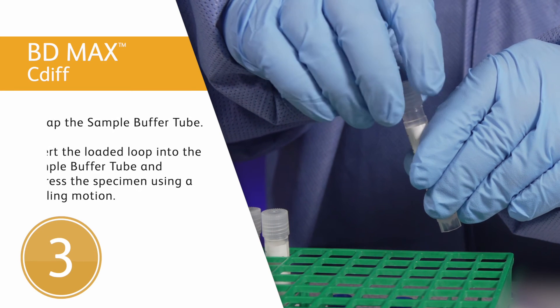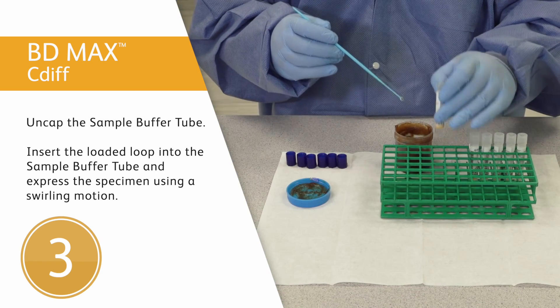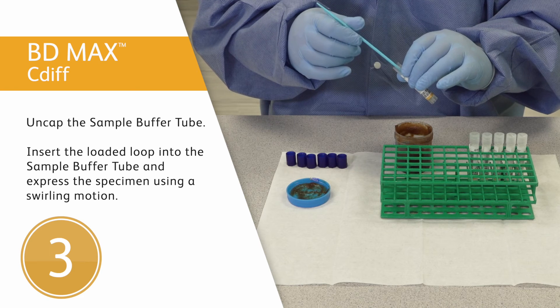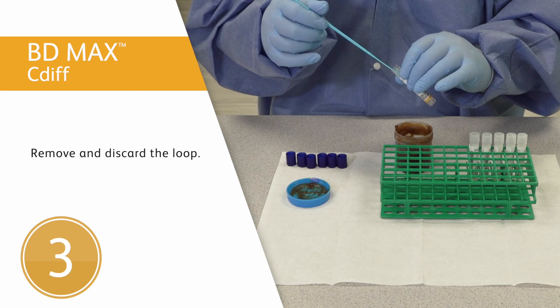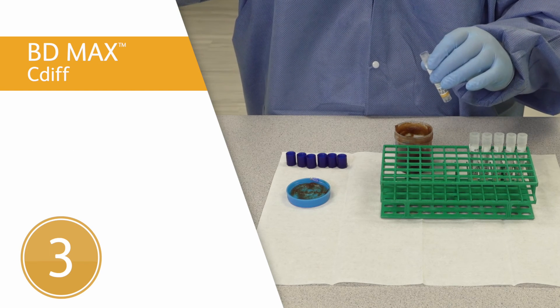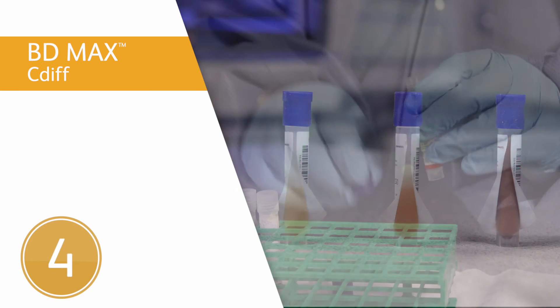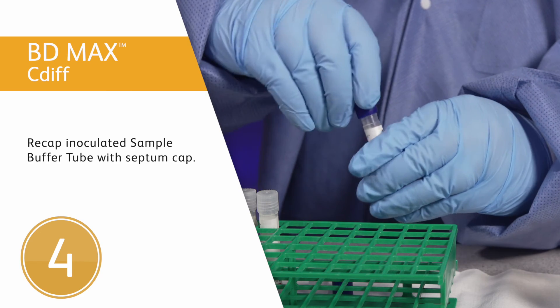Third step: uncap the sample buffer tube and inoculate as follows. Insert the loaded loop into the sample buffer tube and express the specimen using a swirling motion. Please note, it's not necessary to remove the entire specimen from the loop. The solution in the sample buffer tube should appear tea-stained in color. Fourth step: recap the inoculated sample buffer tube using a septum cap.